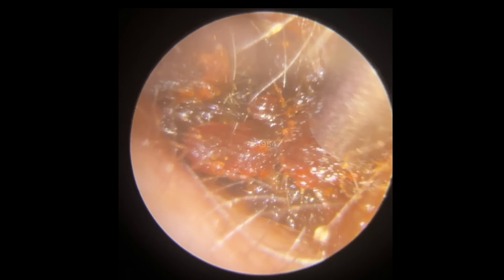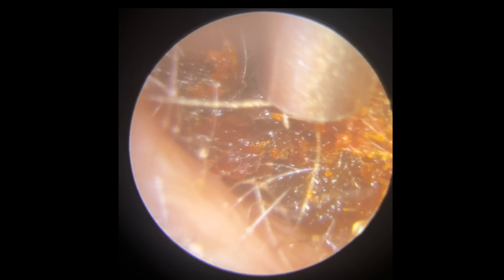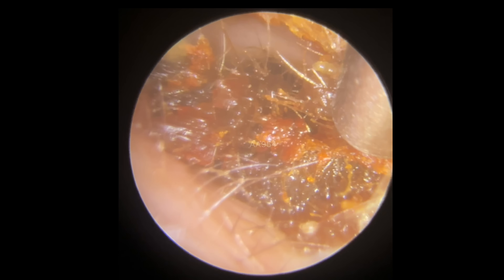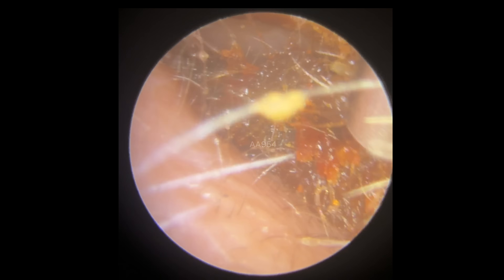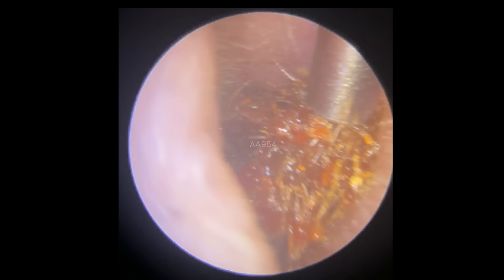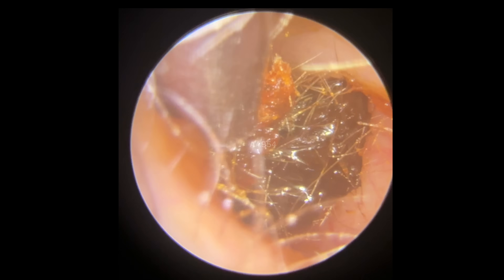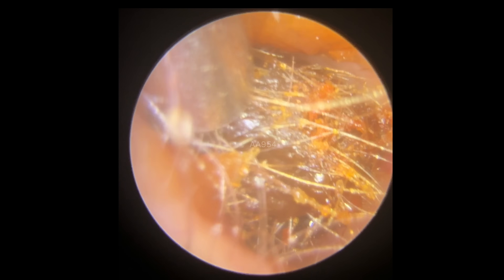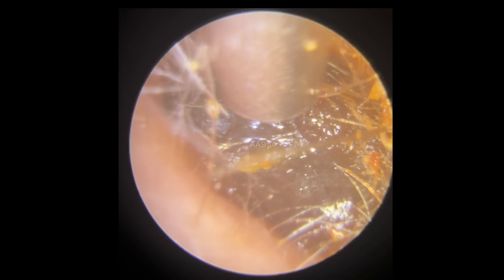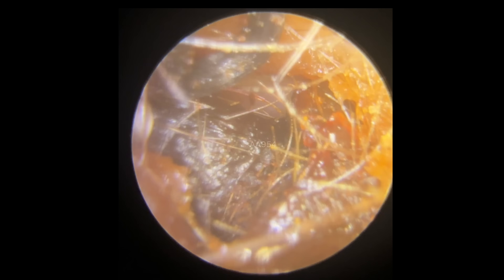Now we just need to pull up from the bottom of the canal here and detach this off the canal. Somebody pointed out in the comments that it seems like I'm pointing out the obvious — 'we can see you've switched to different tools, why tell us you're using the same Jobson horn if we can see it?' The reason I do that is because regular viewers have a good understanding of our tools and techniques, but there are always going to be people for whom this is maybe their first video. It really helps them feel involved and understand what's going on rather than assuming everyone knows what the Zollner tube is.